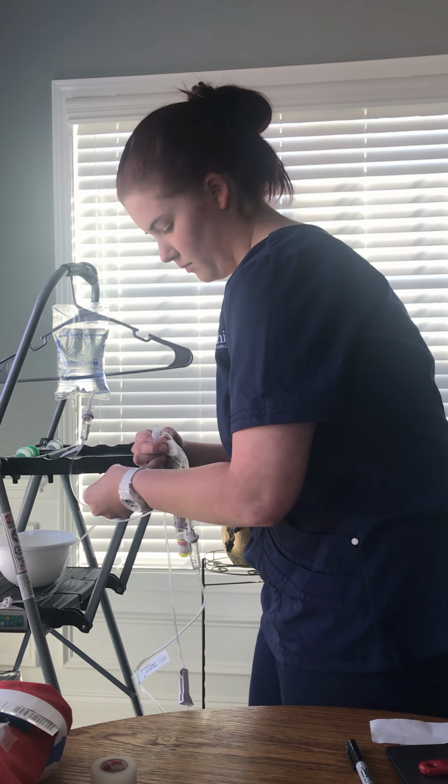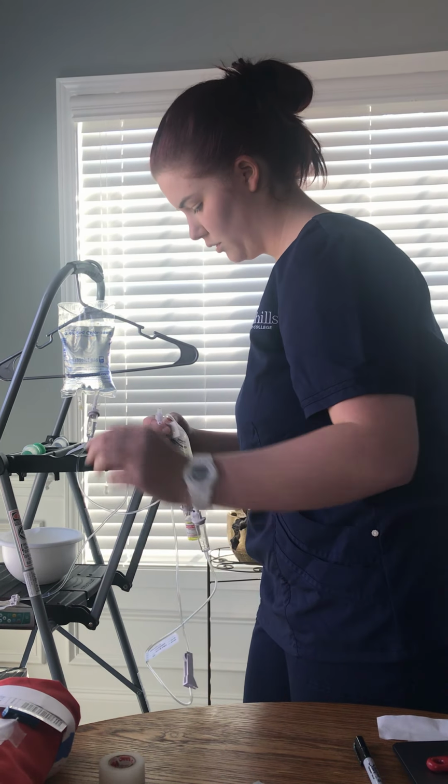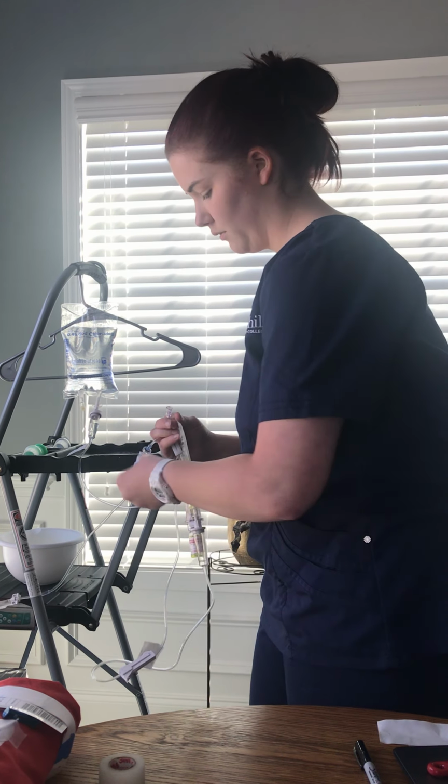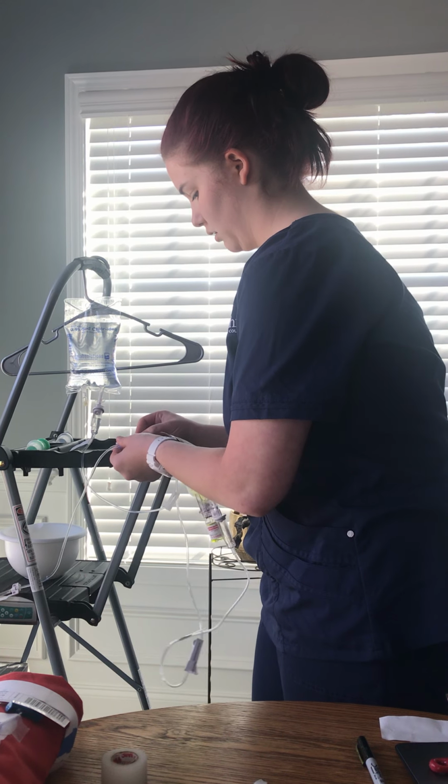Seconds, scrub it up, trash, and not touching anything. Get this cap off, this on.